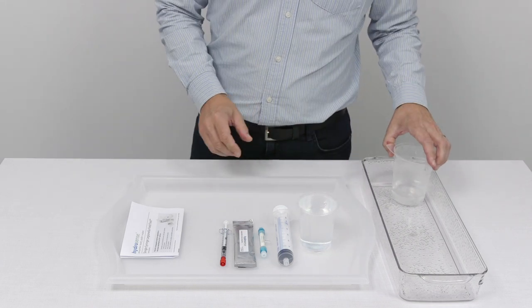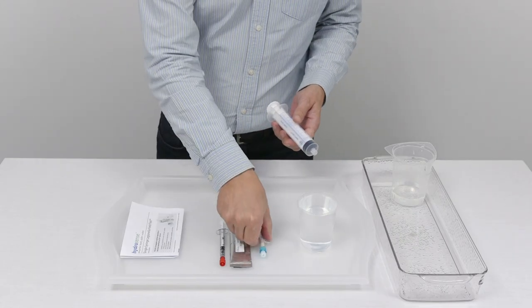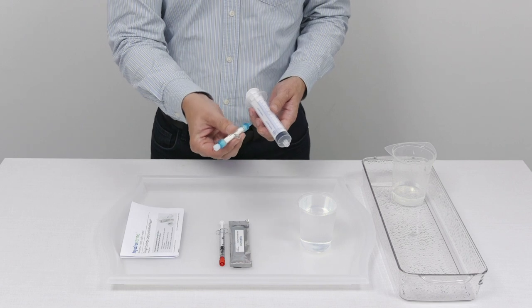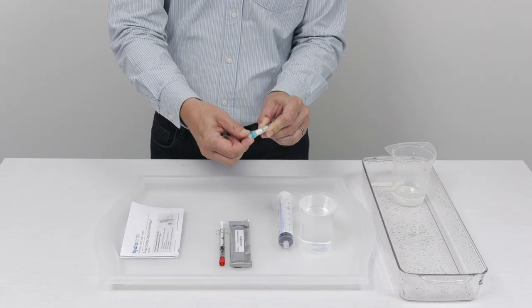Once we've collected this water sample what we need to do then is draw up the sample into this 60 ml syringe and then we will pass that liquid through this hollow fibre filter. Prior to using the filter we just tighten the end cap to make sure that's securely on the filter.